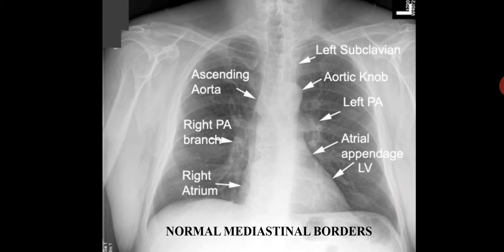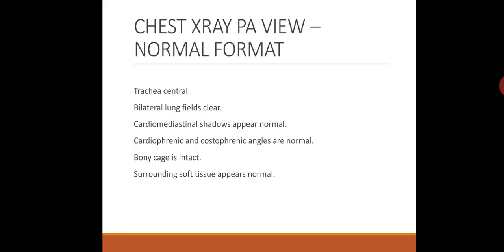Here, between the diaphragm and the ribs, both of which should be clear.